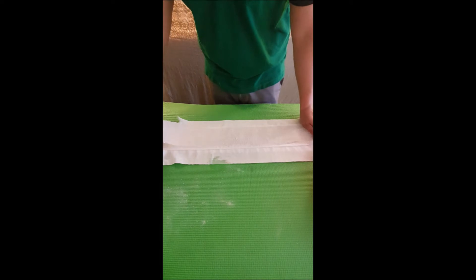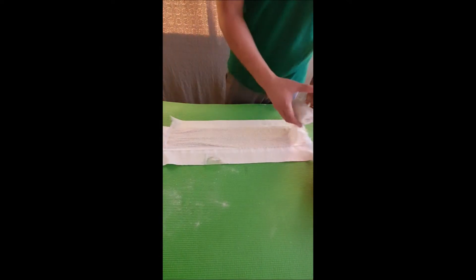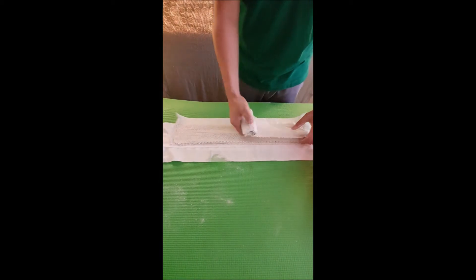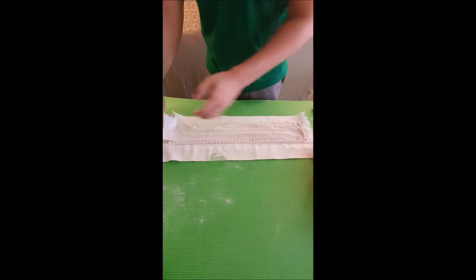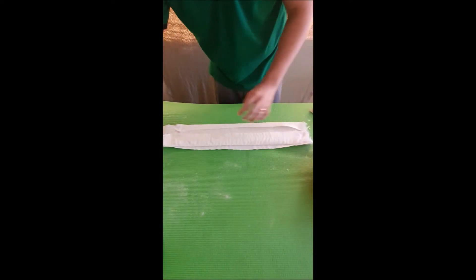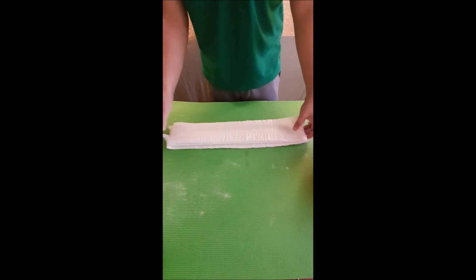We will now roll this over our prepared wadding sheet, making sure that we have around 8 to 10 rolls. After that, we cover this with our prepared wadding sheet again, and then we apply it to our patient.